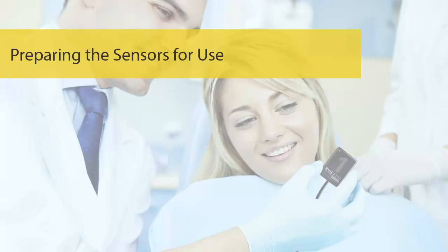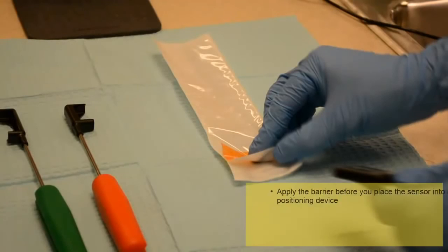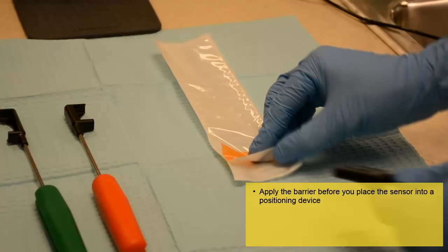Preparing the Sensors for Use. You must cover the sensor with a barrier prior to use. Apply the barrier before you place the sensor into a positioning device. If you need to change positioners during use, you do not have to reapply a barrier. To begin, select the appropriate barrier.